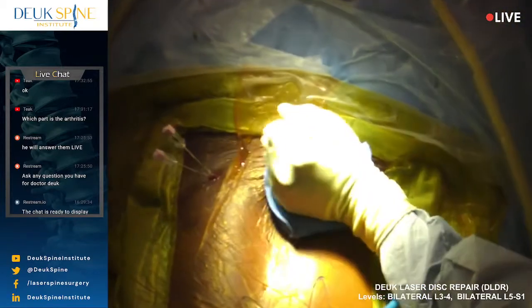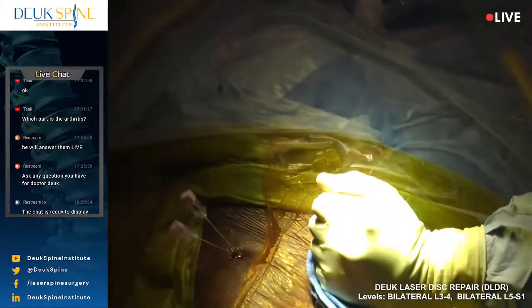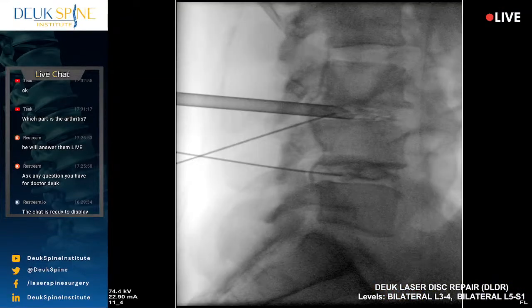All you need is 10 millimeters of mercury, as long as the patient doesn't have venous hypertension, right? But 10 millimeters, 12 millimeters of pressure keeps any blood from the veins from coming out, and it basically keeps the muscles from being inflamed.